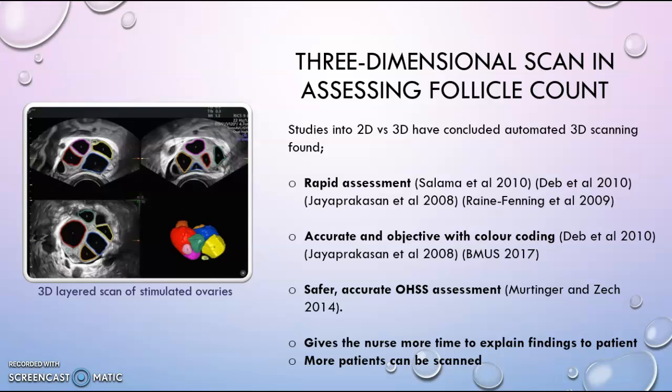3D ultrasound offers accurate evaluation of size and volume of complex structured follicles. Though previous systems have taken longer to process the data, the use of 3D ultrasound in reproductive medicine, combined with automated measurement of follicular size, provides a fast, valid, objective and reliable standard of care, particularly in ovarian hyperstimulation syndrome assessment. 3D ultrasound imaging has proved to be far more accurate, as seen on the slide.